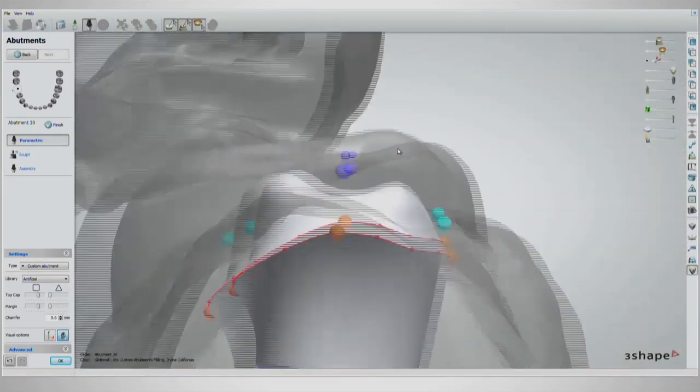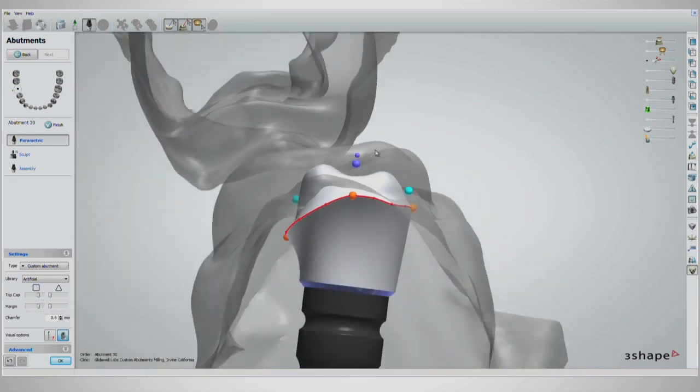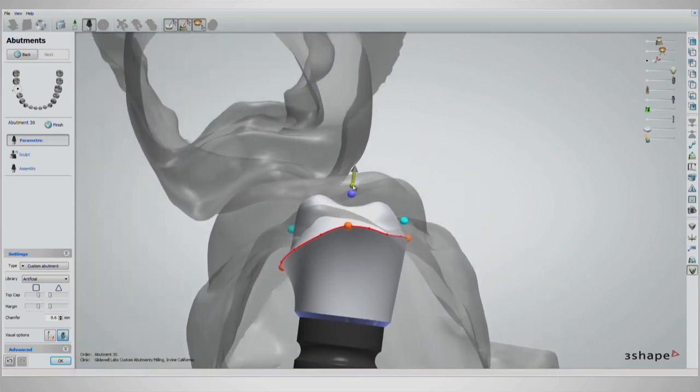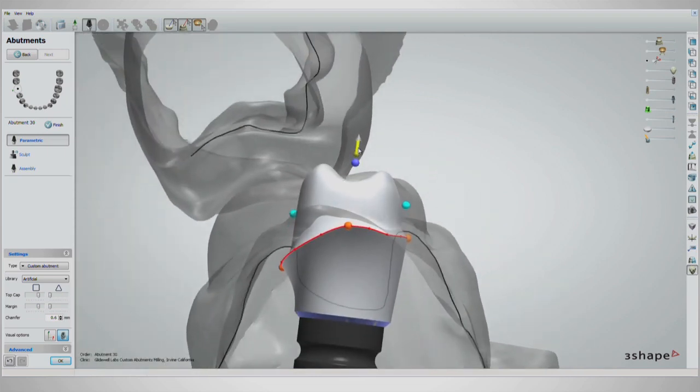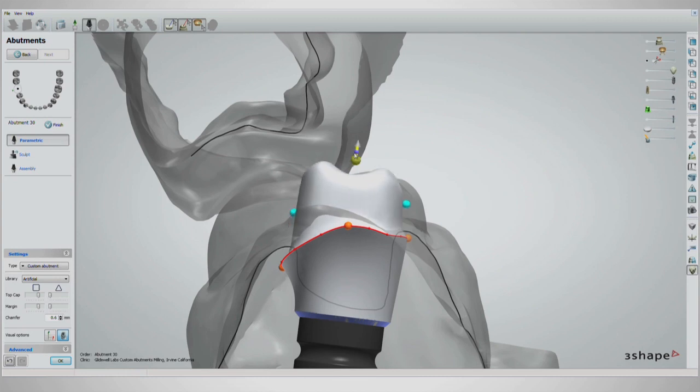From a side view, the abutment can be made taller by clicking either one of the purple handles and dragging upwards. The small handle makes sharper cusp tips as you drag upwards, while the larger handle maintains your current design as it is dragged upward.